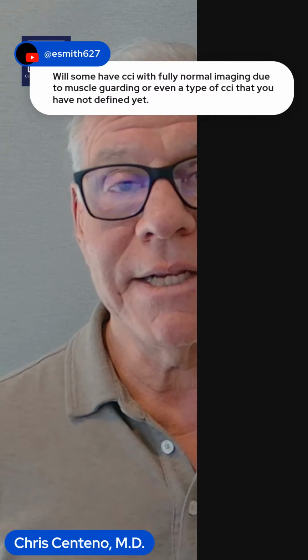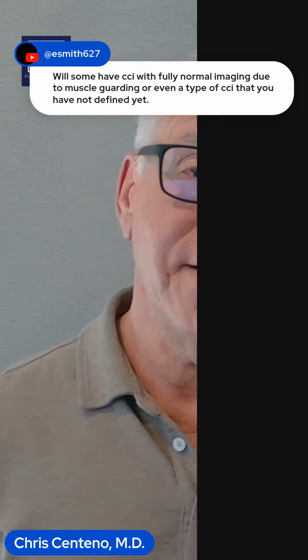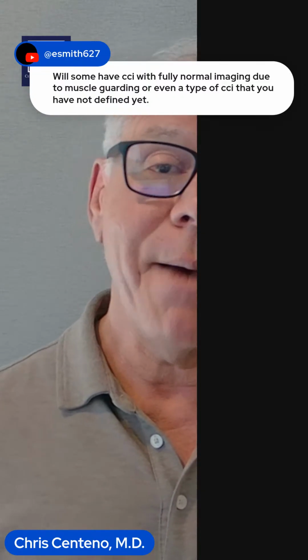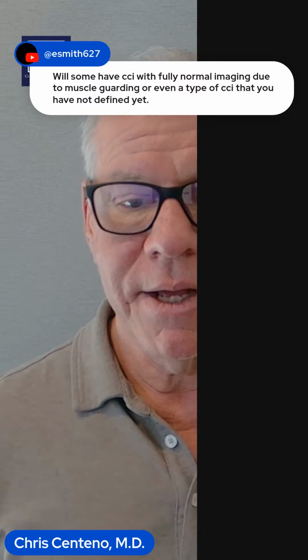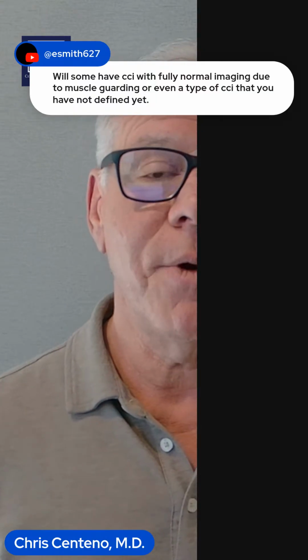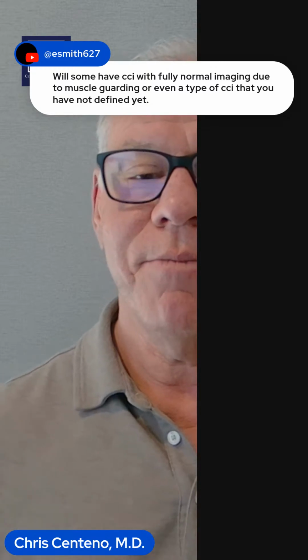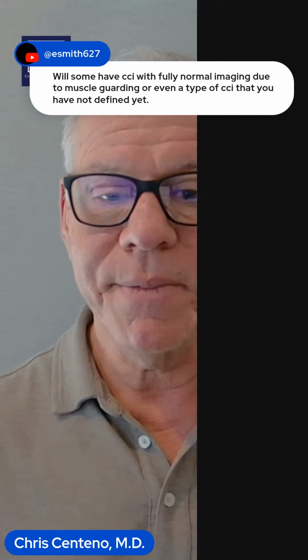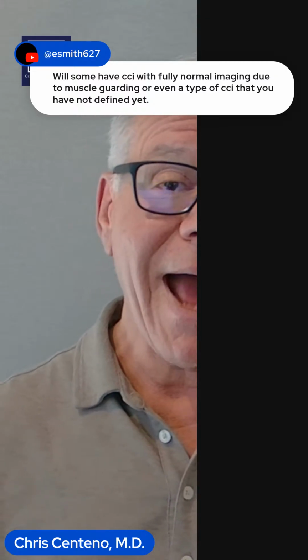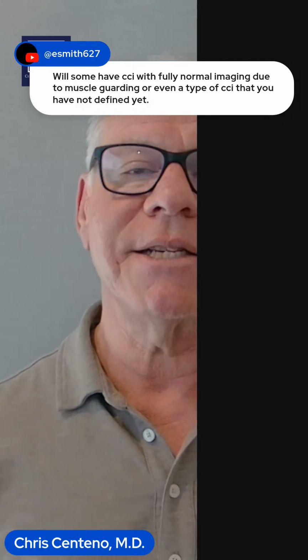Right now, we're defining CCI by things that humans can easily understand, right? Does this part move too much against that part during this movement? But there's probably more subtle patterns there that we're not picking up that probably do represent instability. And hopefully over the next 5 or 10 years, that kind of medicine will blossom.